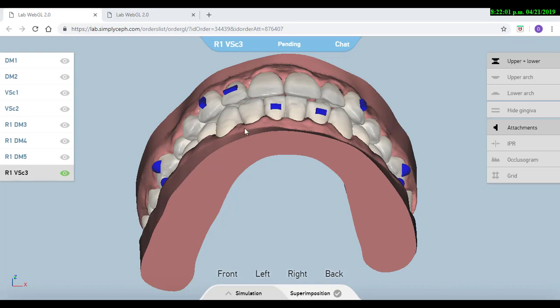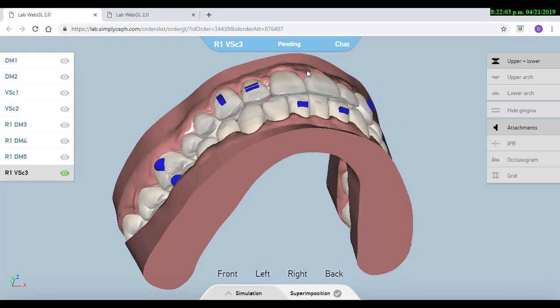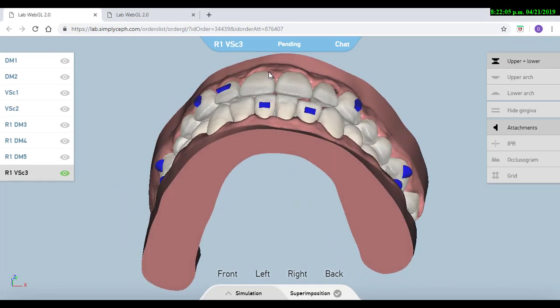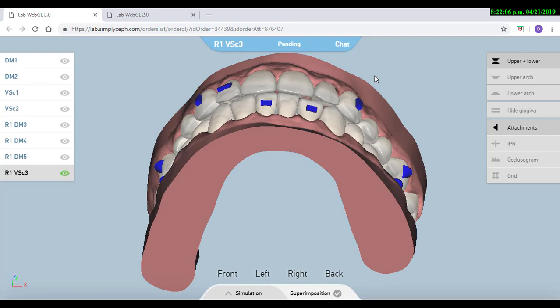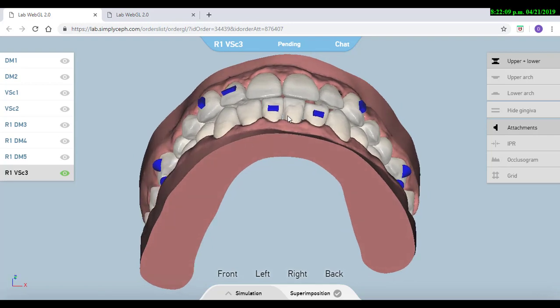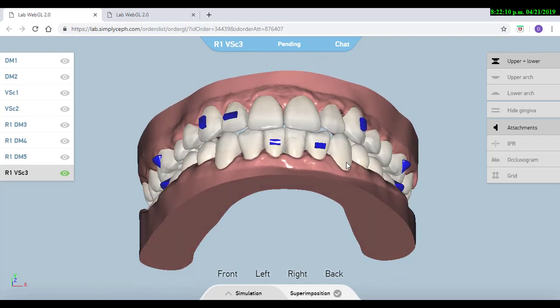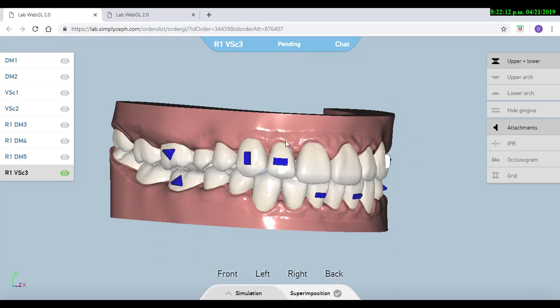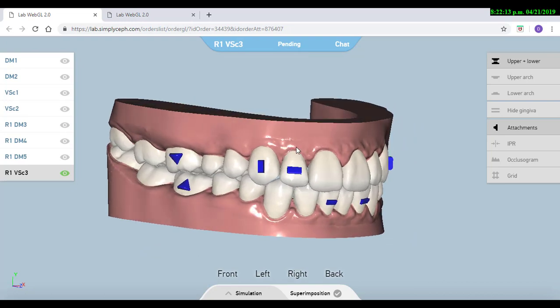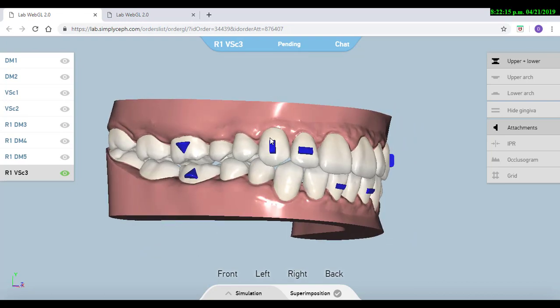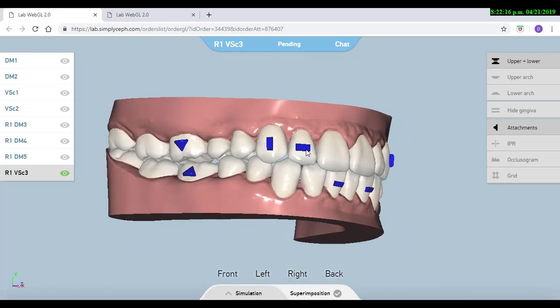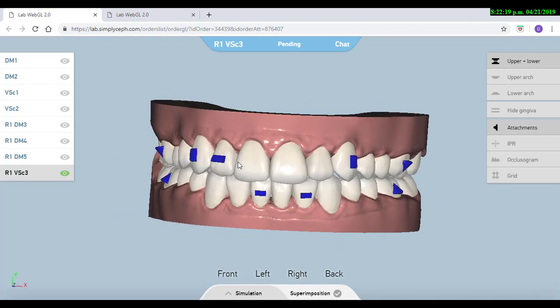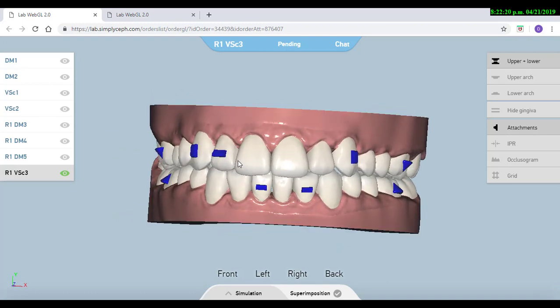For example, in a case just like this one when we have a very tight overjet, then one thing that we can do is just to add IPR between canine to canine, or if we see the laterals are too small compared to the centrals or the canines, then we can open the space around them to place veneers at the end.